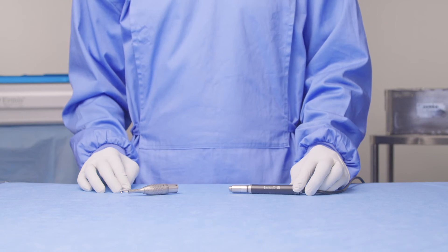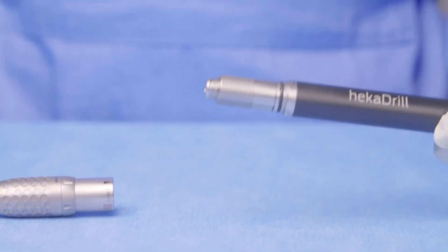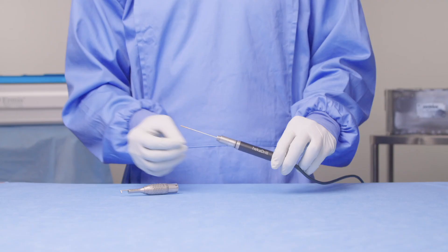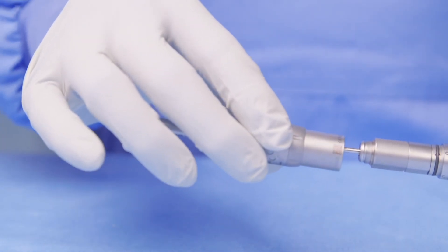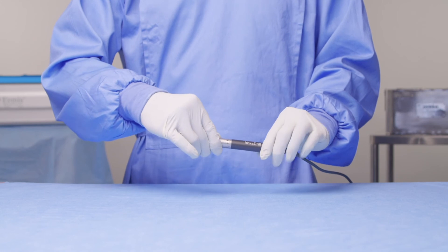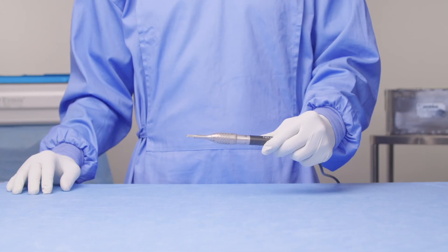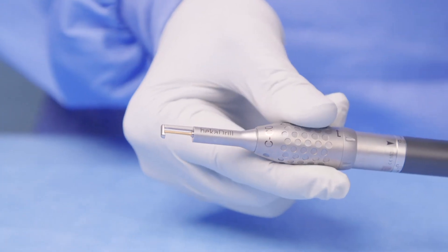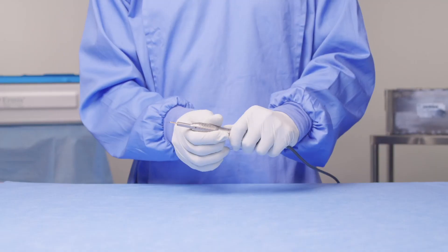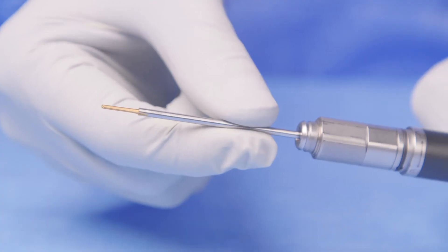Now let's look at how to use your craniotome attachment. Firstly, you'll need to select the correct cutting accessory for the size of the craniotome attachment being used. Take your handpiece and cutting accessory and slide the cutting accessory straight in, firmly into position. At this stage, you can take your craniotome attachment, slide it over the cutting accessory and into the unlocked position on the handpiece, then twist to the locked position. The craniotome is now ready for use. Once finished, grip this collar here and slide forward without twisting, then twist from the locked to the unlocked position on the handpiece. The craniotome attachment can then be slid off over the craniotome cutting accessory and placed to one side. You can now remove your cutting accessory.